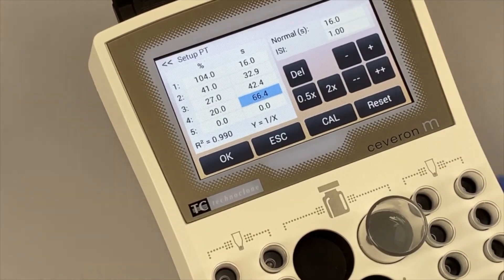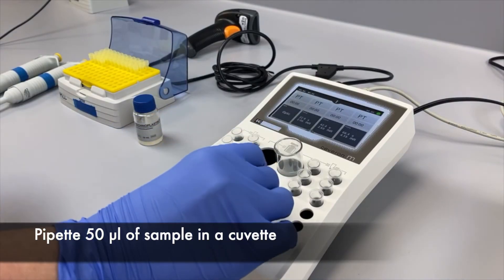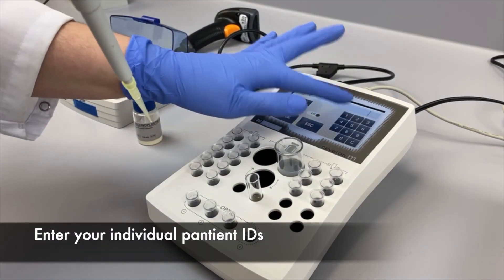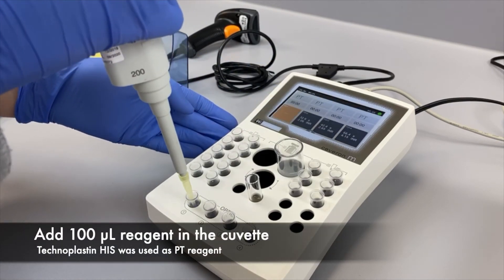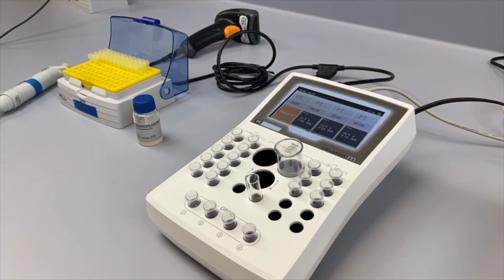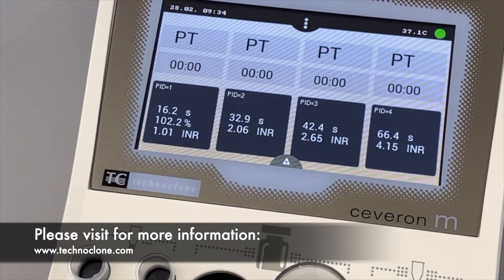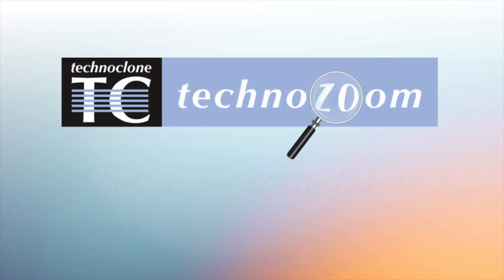Now your instrument is ready to measure QC and patient samples. If you are interested in more information on the Severn M series or other Technoglone products, please visit our company website or contact your local distributor.